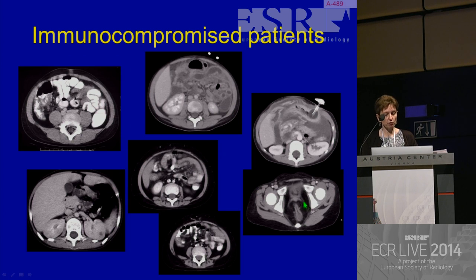This is a patient with rectal stumpitis, and they were querying post-transplant lymphoproliferative disorder in this patient who'd had recurrent flare-ups from their time of multi-organ transplant. And this is another patient. This is infective colitis in a patient. Again, some of these images are several years old now, and I think that with more modern ultrasound, ultrasounding them would be of benefit, and may well give you the answer without having to resort to CT, particularly in younger children.